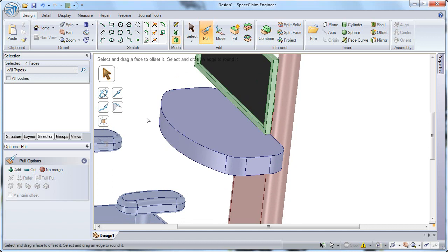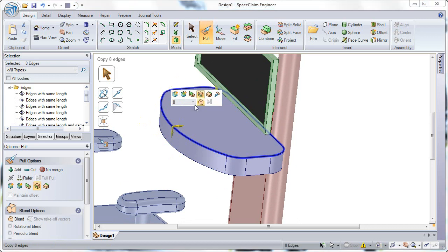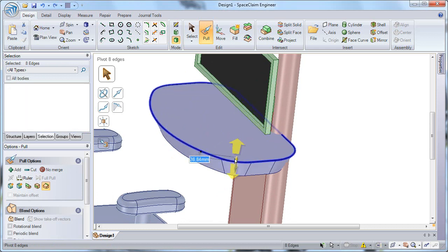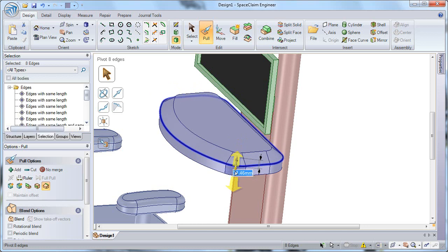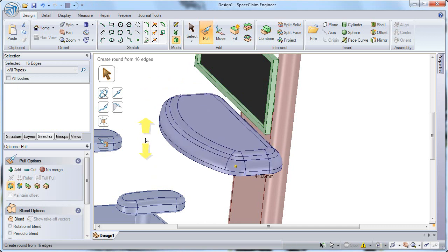So again, I'll double click on the front edge of that table to select the entire chain, copy that chain inward to create a pivot point for that base, and now double clicking to select the outside edge chain, I can pivot that edge either into the part along the horizontal arrows, or if I escape out of that, I can select on the vertical arrows to pivot that downward, which is the motion I'd like to make. Now if I control click, double click on the other round chain, I can now pull on both of those edge chains simultaneously to round that table.